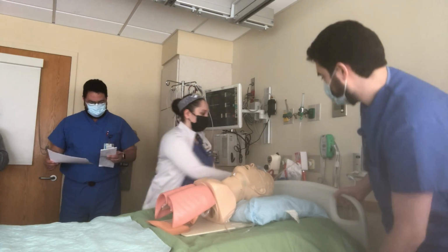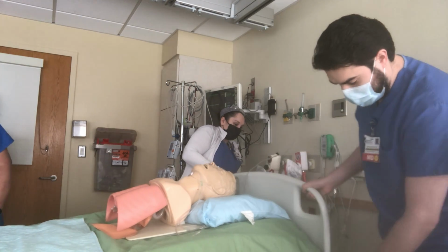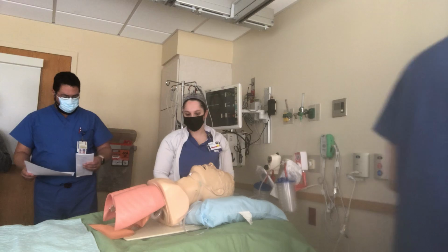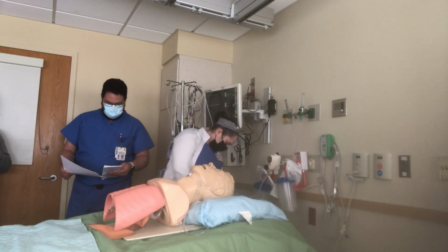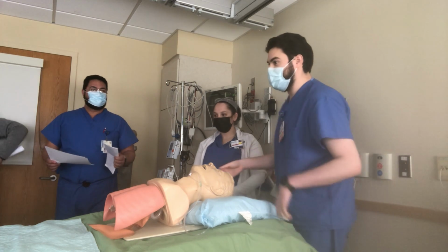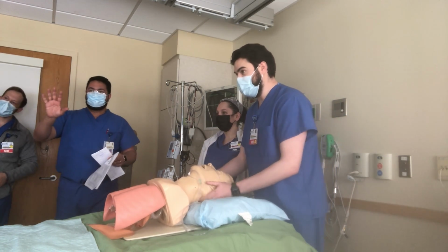Remove the top of the bed. Pull it up. Okay. Now put it somewhere. And now go behind the patient. Lock the bed. And you stand behind the patient. And then what are we gonna do? We can start getting the stuff prepared, and I can ventilate in the process.